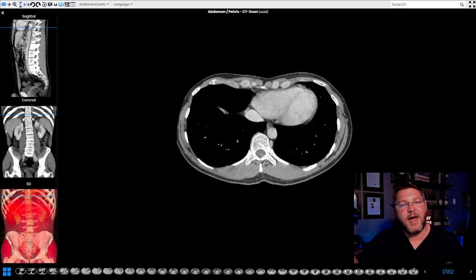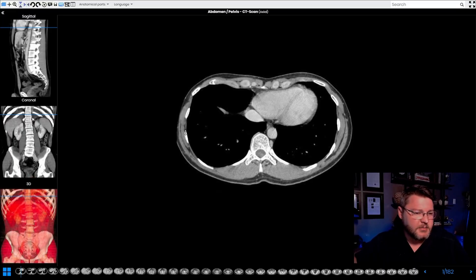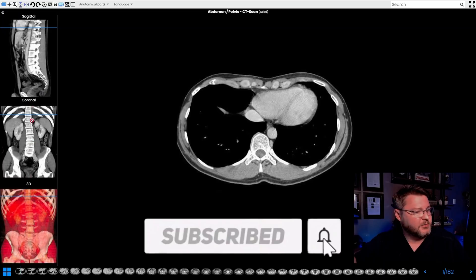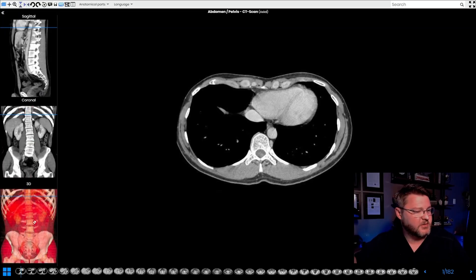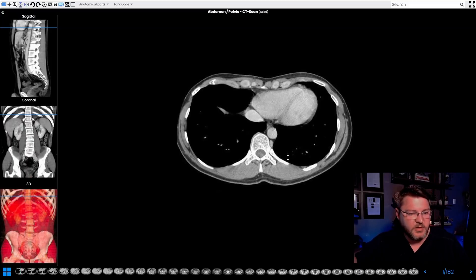Hey everybody, today we're going to go over axial anatomy of the abdomen and pelvis. First, if you look over here, this is the ribcage where we're starting out. You can see the spine and backbone. We're starting way up in the chest — this big black area is the lungs, right in the center is the heart, and you can see bright spots for the ribs and spine.